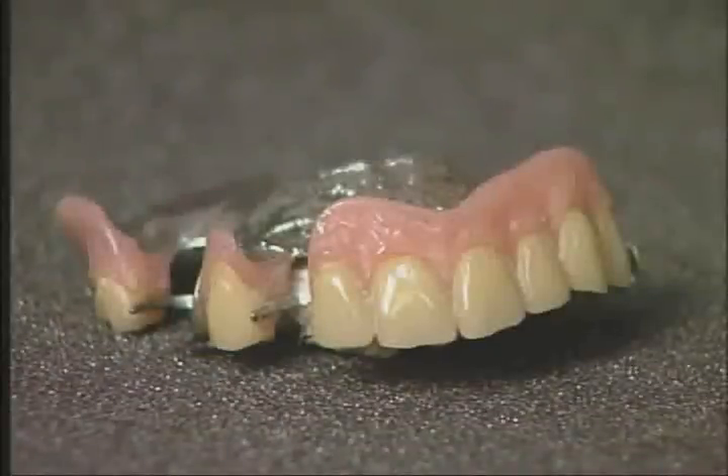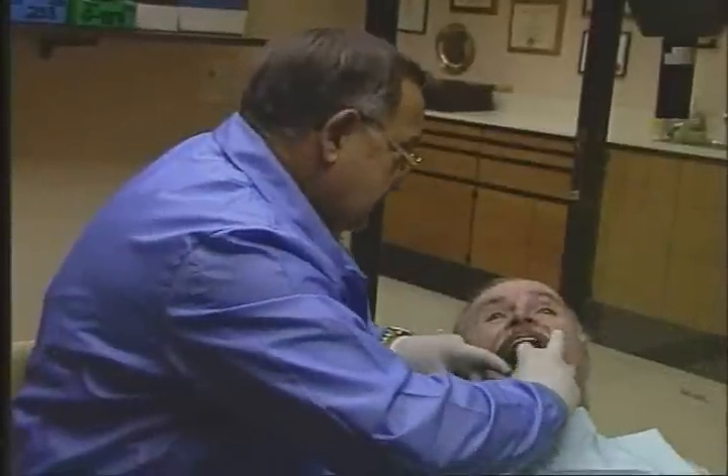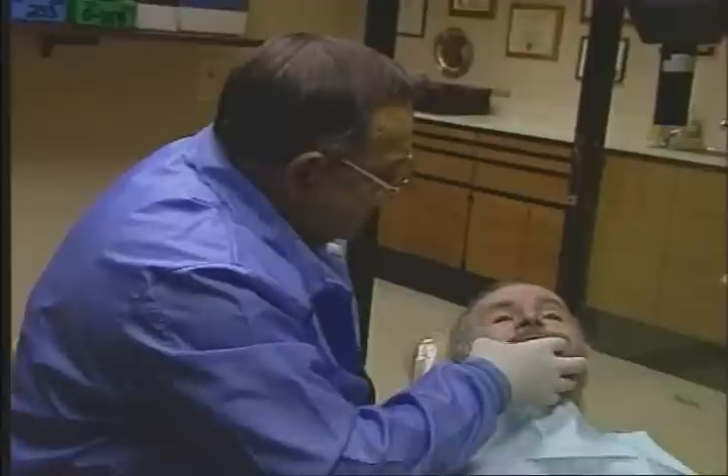With the Equipoise system, your removable partial denture is the end itself, not the means to the end — a full denture. Today, the Equipoise system for removable partial dentures is being practiced by thousands of dentists and is recognized as the finest way to preserve and protect your patient's teeth.